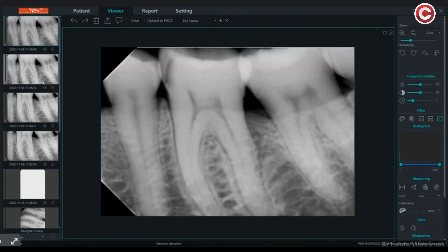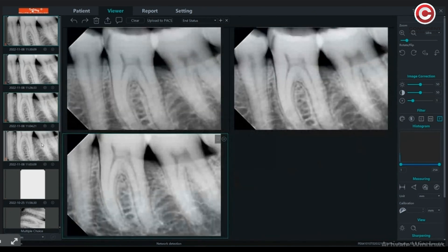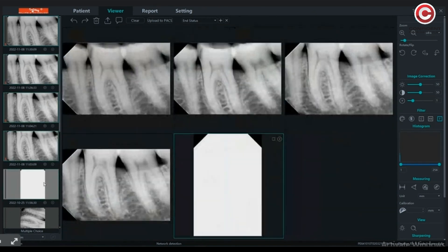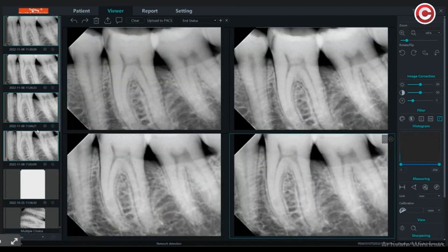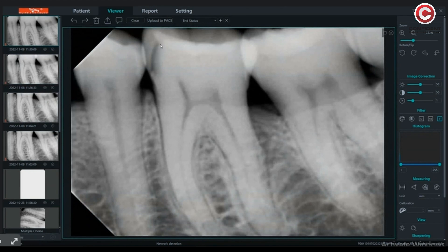Using the image viewer tool, you can view multiple images in the same window. Add images to the window by selecting the ones you want to add. The images in the window can also be removed.